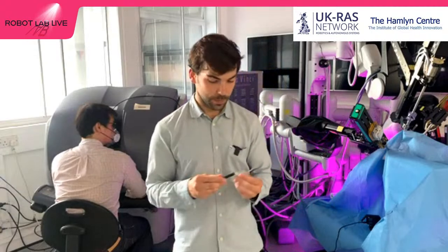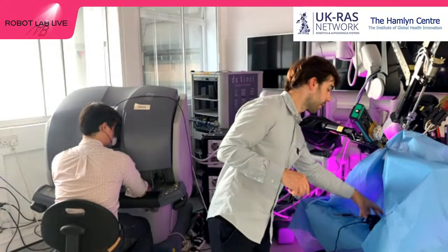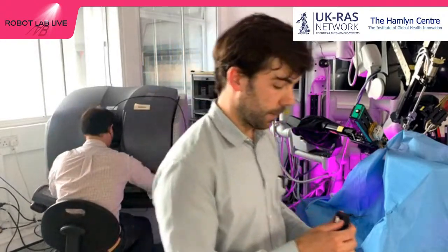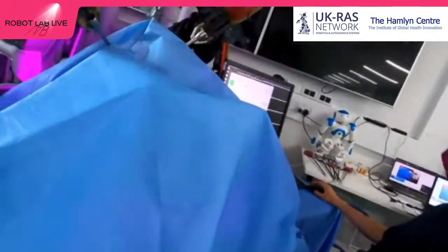And another thing that could be done here is when you think about neurosurgery, for instance, or other types of very small surgeries, the forces that we apply are very tiny and sometimes you are not even able to perceive them. So we can have the hardware necessary to magnify those forces and be able to perceive them. And that's pretty cool because somehow it's like enhancing your own human abilities, right? And let's stop talking because I think I'm talking too much. We can move to the actual demo with the robot that I have behind me, and you can have a taste of how it works.